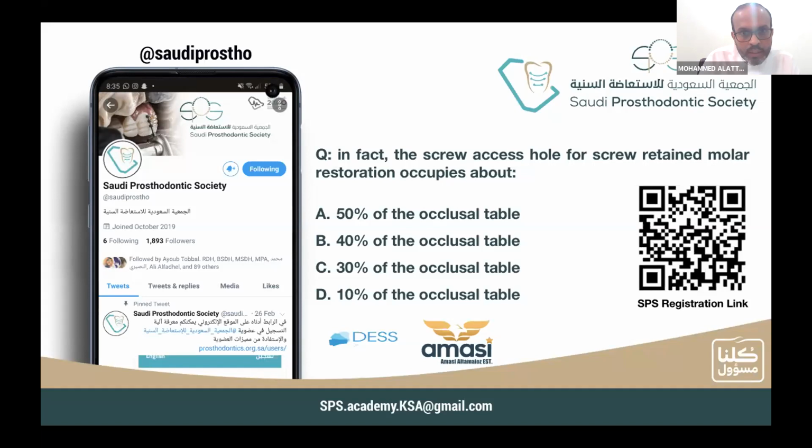How do we decide whether the fixed bridge will be one piece or sectioned? As I talked about, we replace each missing tooth with an implant, and for your crowns, whether splinted or not, there are some factors: the bone quality of these patients, whether the patient was managed with non-standard implants like short or narrow diameter implants, and whether the area is augmented. This gives us a guide on whether we can connect or splint our final prosthesis.